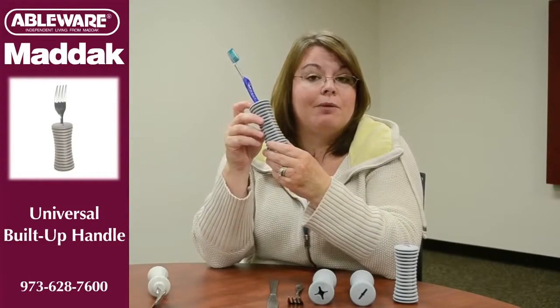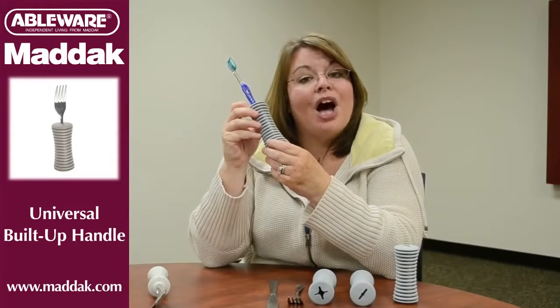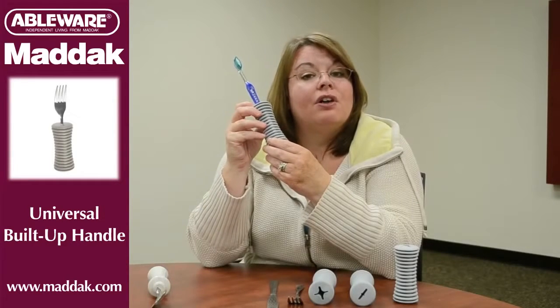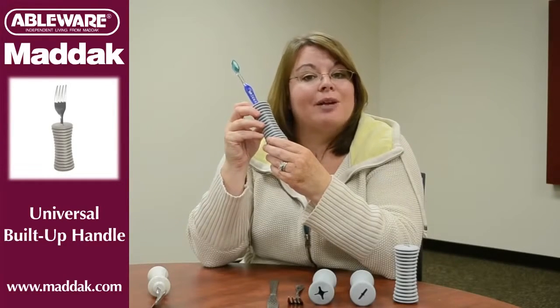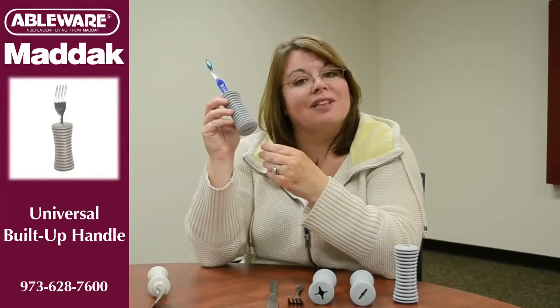Cleaning the universal handle is not a problem because it's dishwasher safe, so you just run it through the dishwasher. I hope you found this information useful. If you'd like more information on the universal handle or other Maddak products, please visit our website at www.maddak.com. Another problem solved.